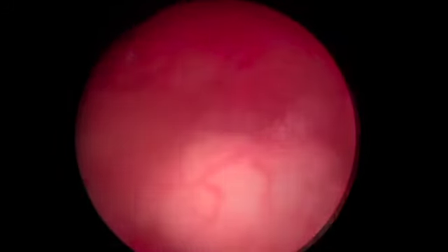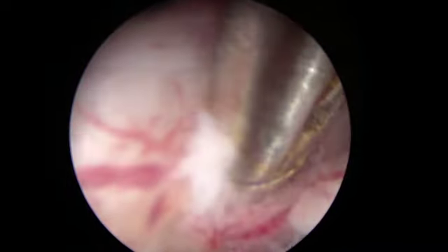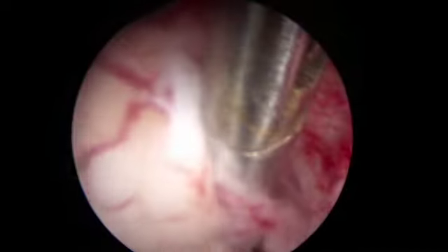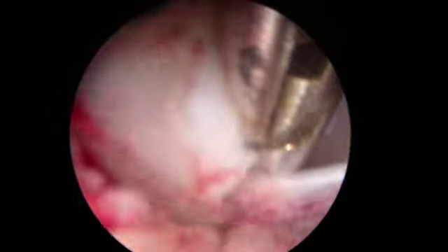A close look will show you irregular vessels on the surface, and now we change the angulation of the grasper and twist the polypoidal lesion so as to gradually remove it outside the cavity. The rest of the cavity appears unremarkable. Gradually, you can see us removing, and the fibrotic nature of the base can be appreciated.